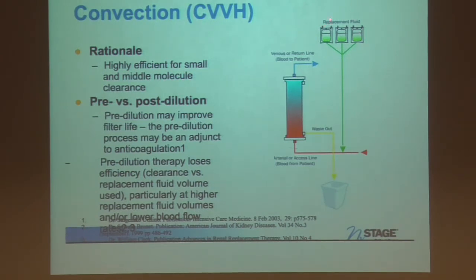Set up the lines for CVH. We have the filter right here. The replacement fluid can either go pre, post. If you run it pre, you end up diluting, less chance of clotting, but you also can sometimes dilute your clearance. On our boards, we get to calculate that.